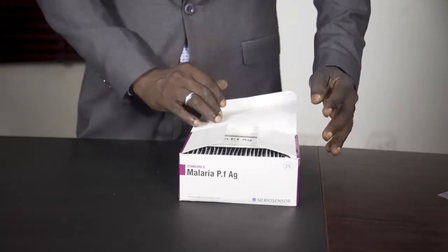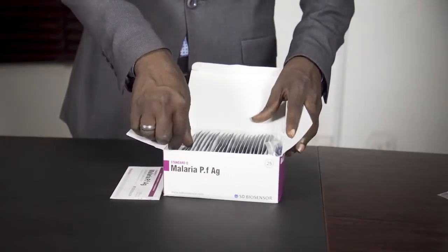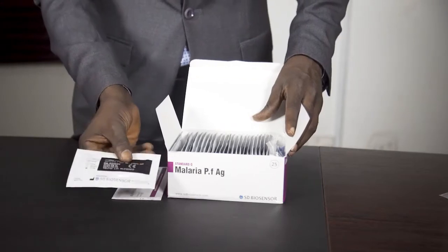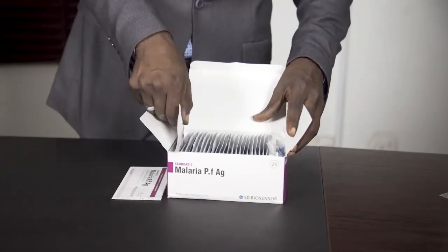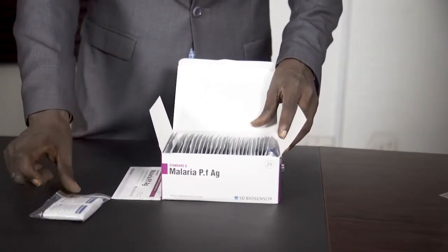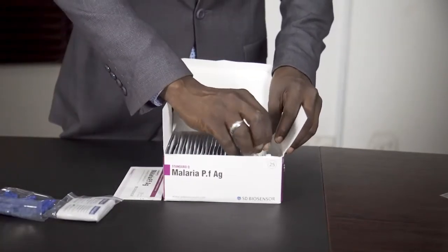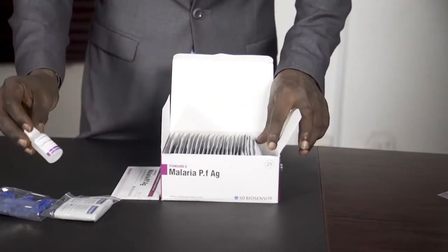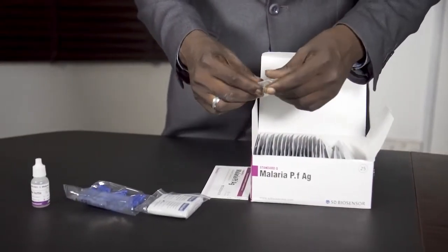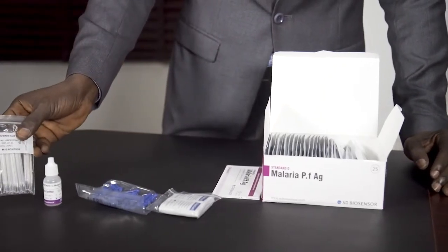When you make a purchase of the test kits, you have this detail inside of it, you have the kit itself, you have the alcohol swab, some lancets, the buffer solution, and you also have the blood sample collection rod.